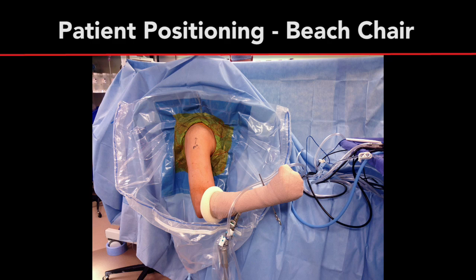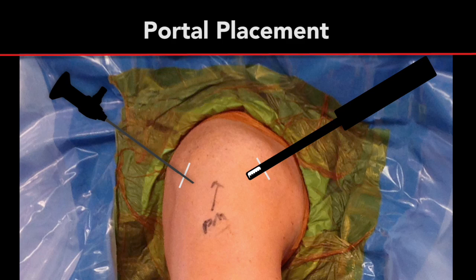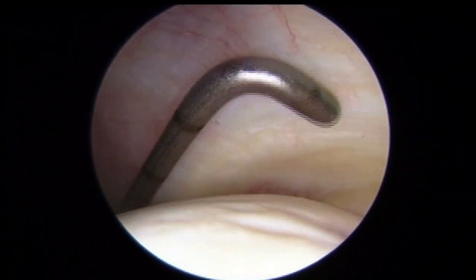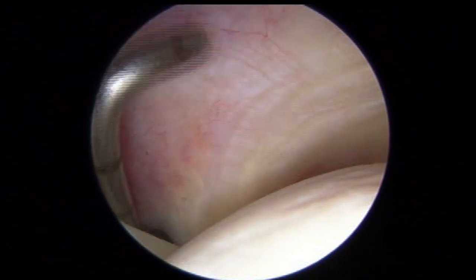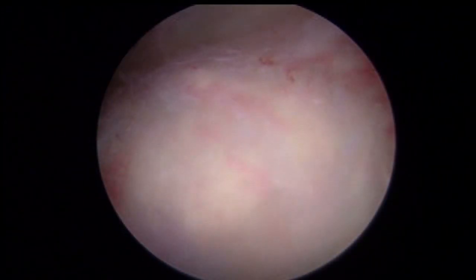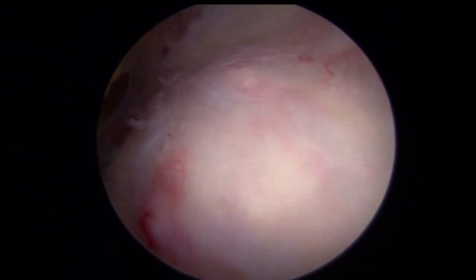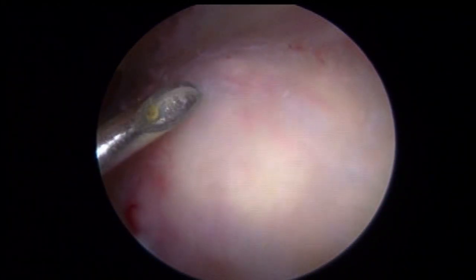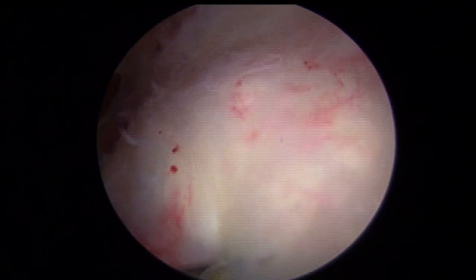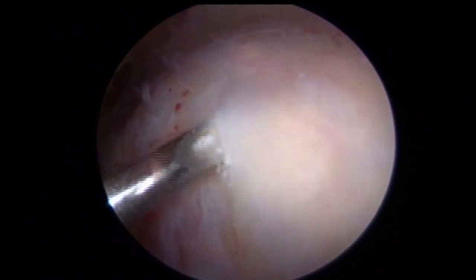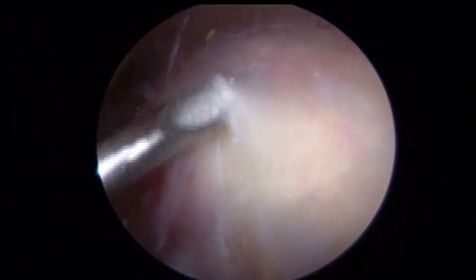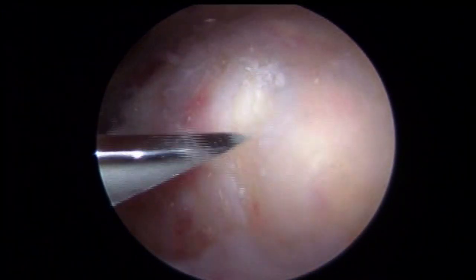The patient was placed in the beach chair position for a right shoulder arthroscopic excision of calcific tendinitis with rotator cuff debridement versus repair. Diagnostic arthroscopy revealed that the articular surface of the rotator cuff tendon was found to be intact. All intraarticular pathology should be addressed at this time. Following an adequate subacromial decompression, the bursal side of the rotator cuff is examined. Gentle probing demonstrates that the supraspinatus tendon is softer than normal.